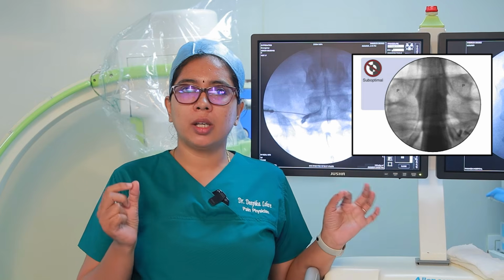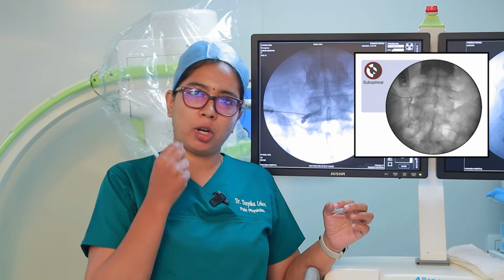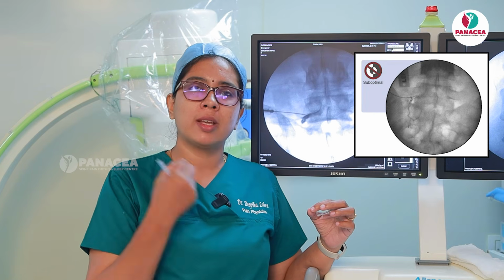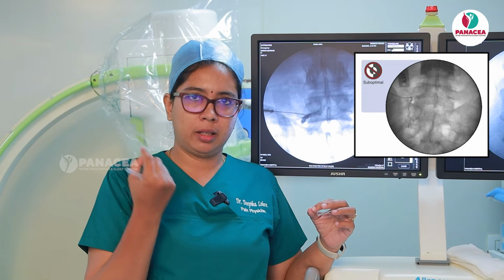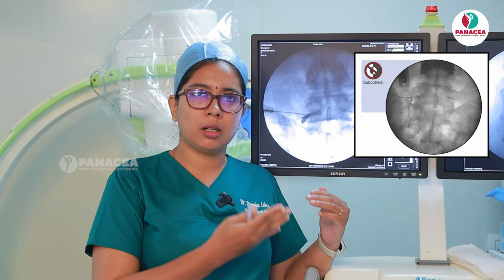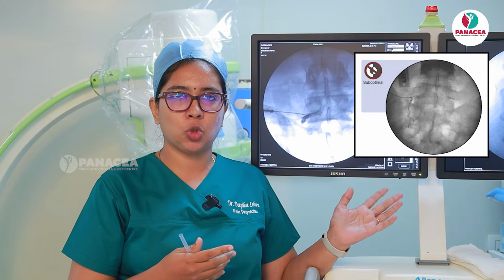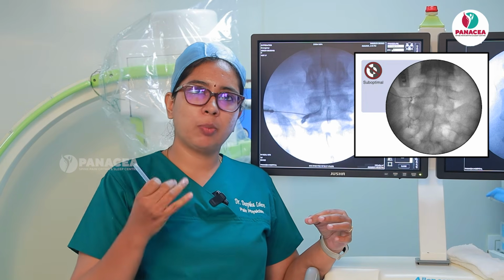Then you may be in some vessel which is in the foramina. The foramina have vessels, and if by mistake you have gone into a vessel, you might not always get a positive aspiration test, you might not always get blood. So when you give the drug and the dye spread is similar to a vessel pattern, that vascular pattern which you can see here, then again you have to reposition the needle.